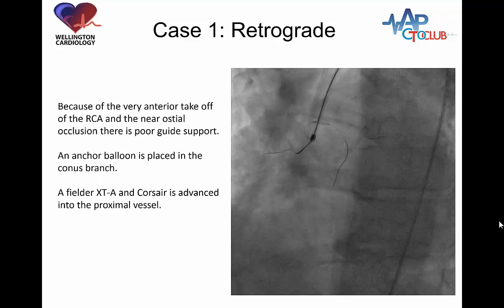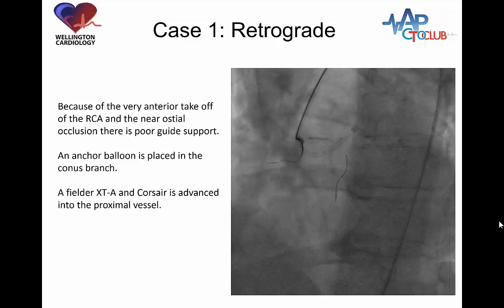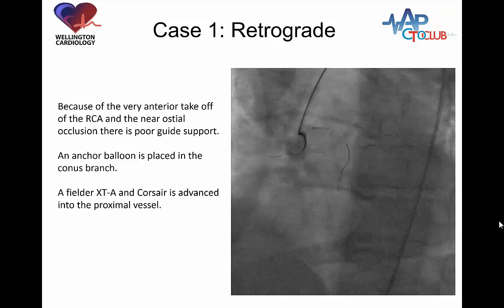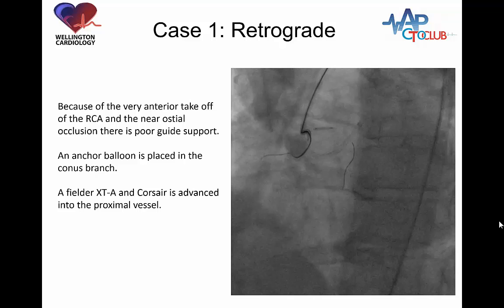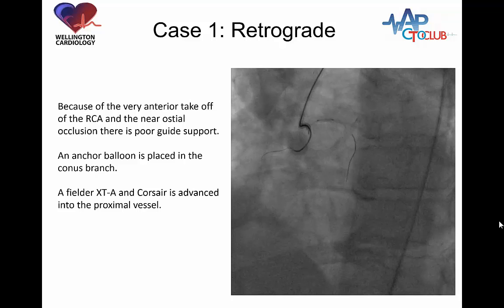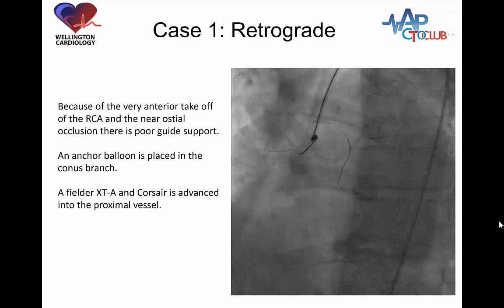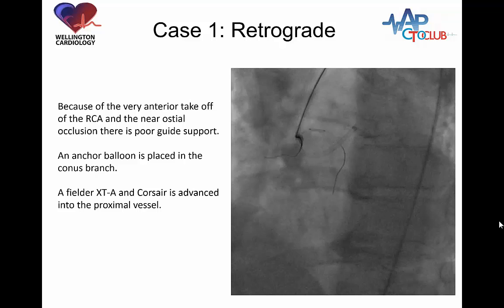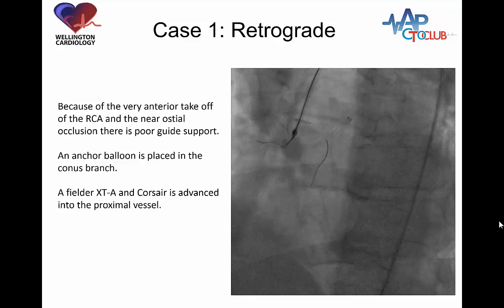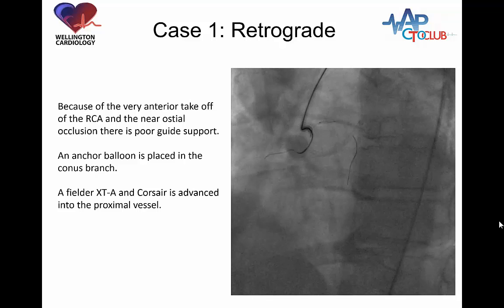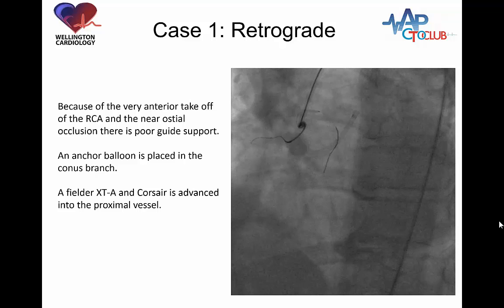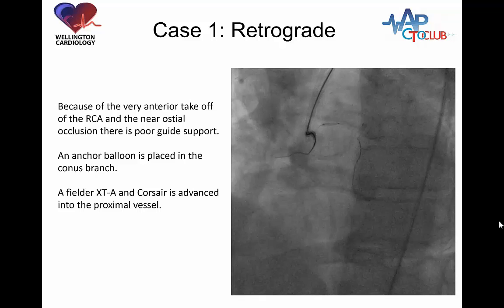We start with some antegrade preparation. There are a number of reasons for this: first, it reduces the amount of time you need to have gear in the retrograde system, potentially reducing ischemia, and it may also provide a target for the retrograde system. The important thing here is that we don't want to use a stiff wire because the course of the vessel is somewhat ambiguous. So we have taken the Corsair and XTA, a relatively soft wire, and made progress down the right coronary artery. Balloon anchoring in the Conus branch was used to provide support.